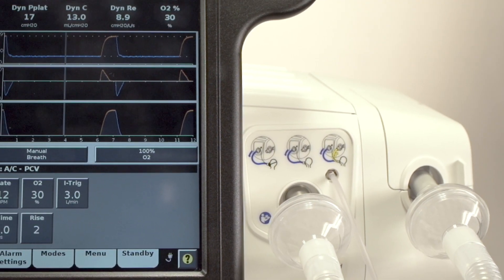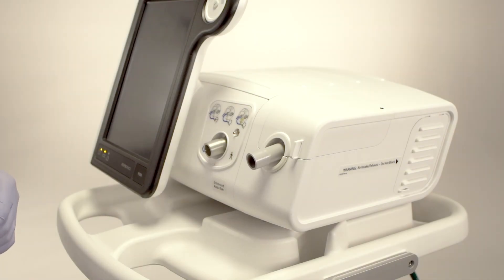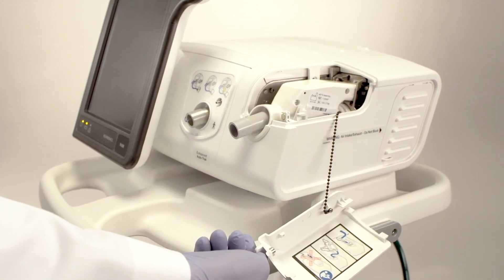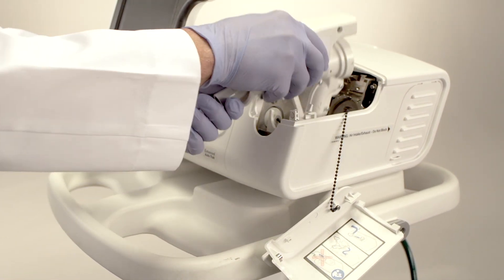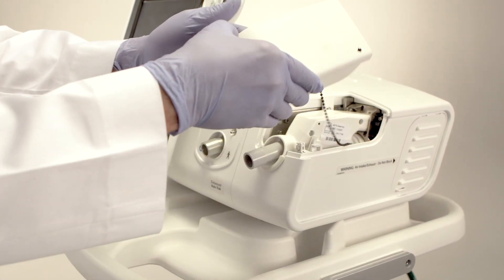The exhalation limb of the dual-limb circuit connects to the inlet port of the expiratory system, or ESIS, cartridge. This component houses the exhalation flow sensor and diaphragm for interfacing with the V680's active exhalation valve. If desired, the ESIS cartridge can be removed and then cleaned and disinfected, or cleaned and sterilized by autoclaving. It is accessed via a removable cover. While standing in front of the ventilator, grasp the tab and slide the cover forward to access the ESIS cartridge. The cover is tethered with a light chain for safety, and the cartridge easily snaps in and out for cleaning and replacement. The cover must be replaced for the V680 to operate.